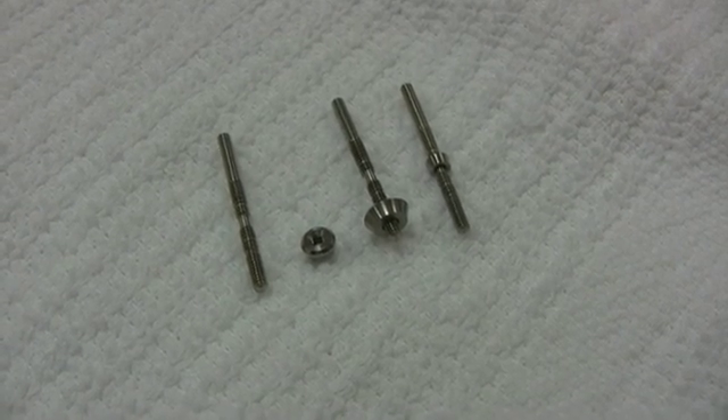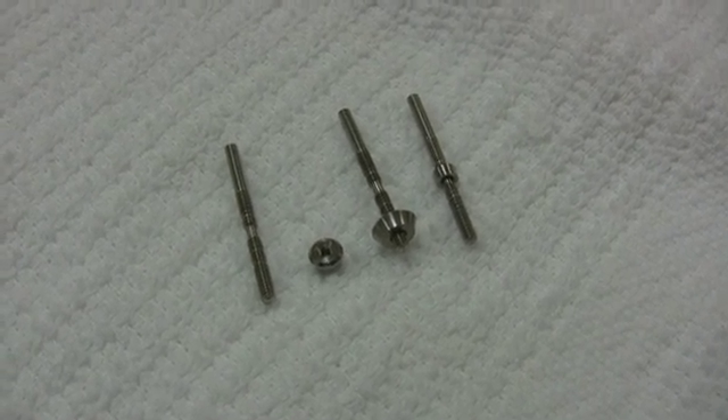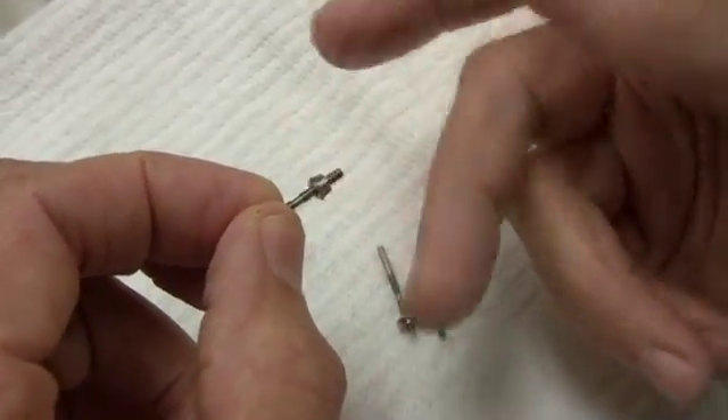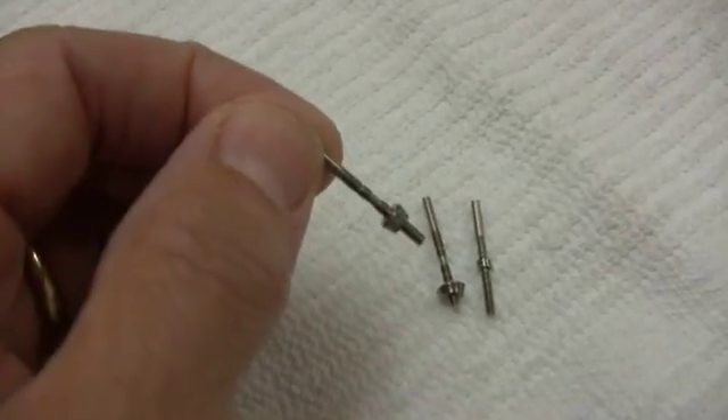With these implants, the crown margin is established on the platform of the implant rather than on the abutment, making the vertical position of the implant extremely critical. The gauge will indicate what, if any, modification is needed.